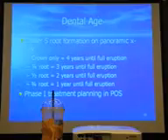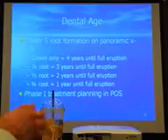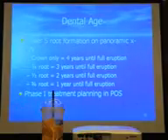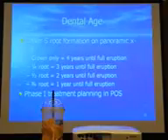If we can only see the crown, we consider 4 years to full eruption. If you can see 1/4 of the root, then we consider 3 years for full eruption.